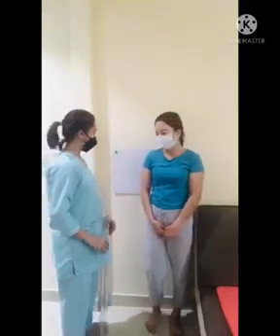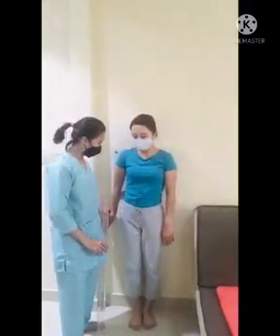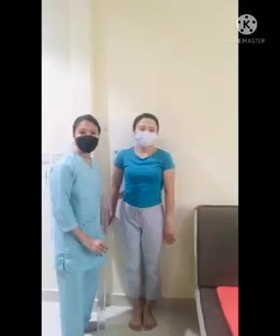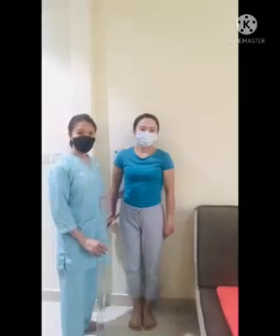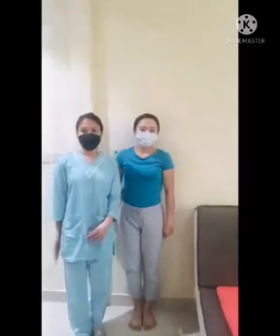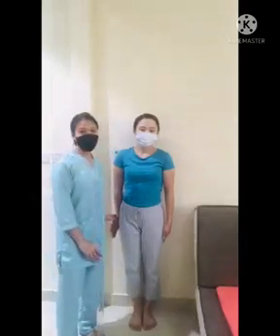So, same position as the upper, but the hand is placed at the side in contact with our IR, with the hip. Ito po yung hip po ng patient natin. Dapat po dikit lang po yung position po ng patient natin. Nakaganyan po siya.